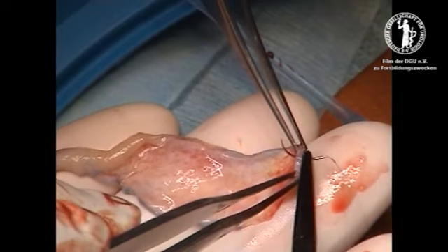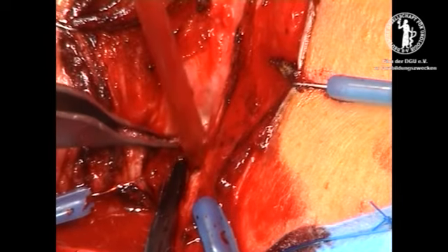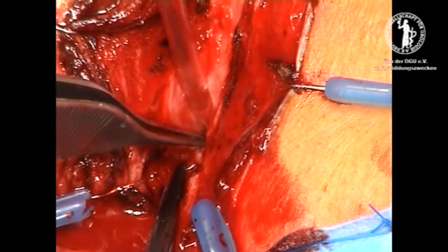The graft is sutured ventrally by running 6-0 Monocryl.